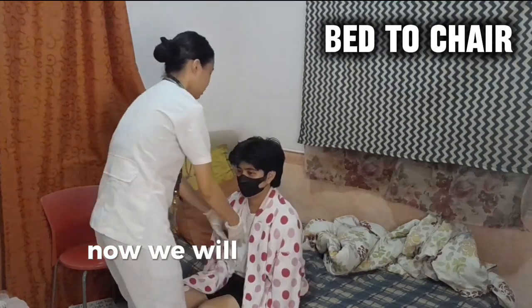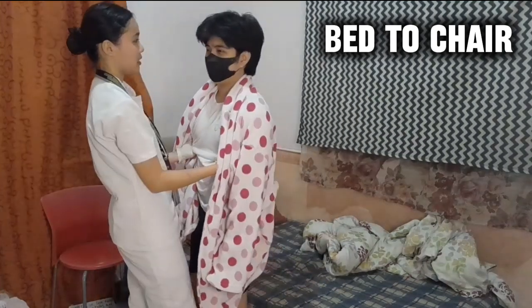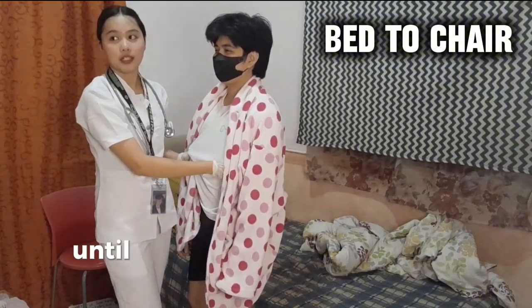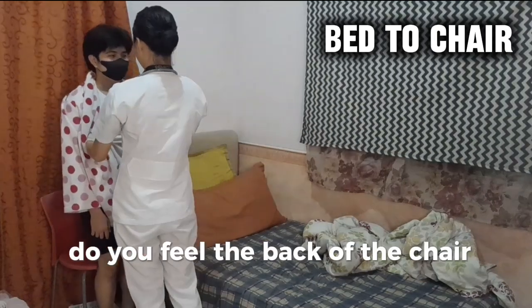Yes, sir, now we will stand up po. On the count of 3, 1, 2, 3. Sir, do you feel dizzy? Sixteen, turn the patient slowly until the back of their legs touch the chair. Slowly po, slowly. Do you feel the back of the chair now?